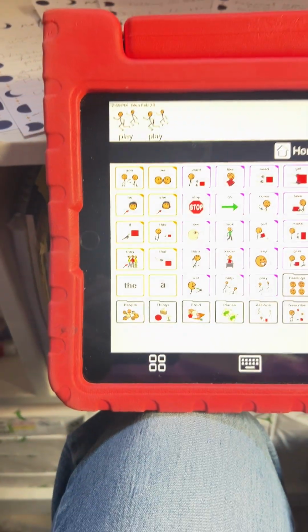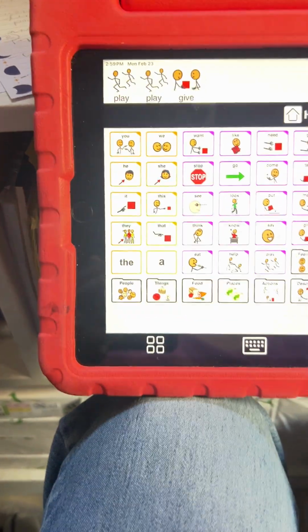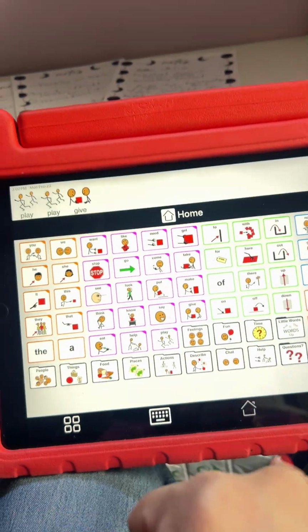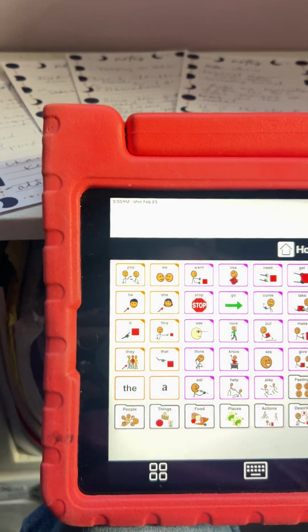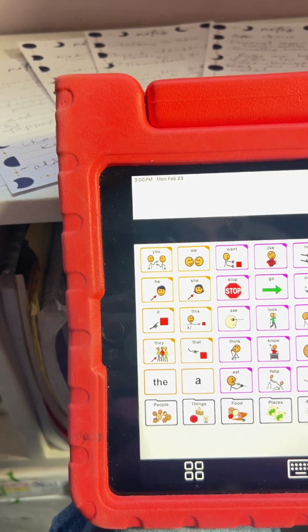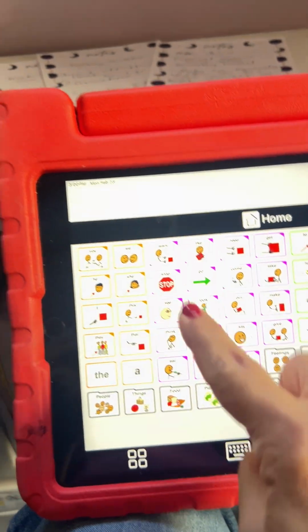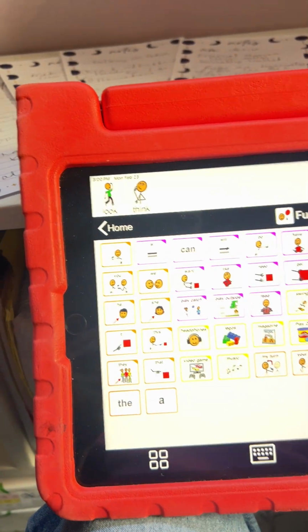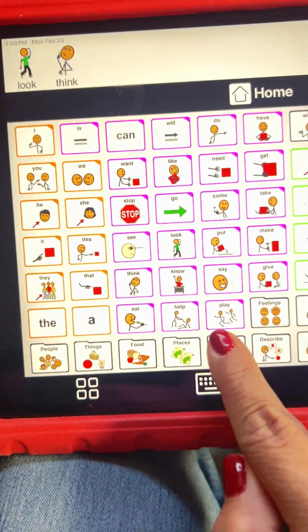And even if she points and picks the wrong one, it's great job for pointing, great job trying, let's go play. And I also incorporate sign language in there so that she's getting multiple successes of, yes, I know you attempted, you're trying, and you can go play. And another clue is where they're really cognitively connecting that this device is telling and describing words that I want, words that I need, since play has been such a preferred one.